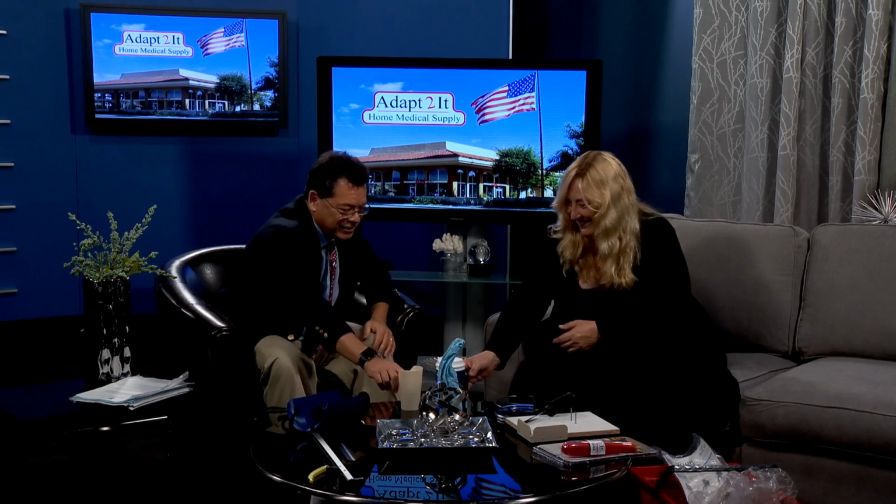Because when we drink, we don't realize it, but we tip our head back to get to the bottom of the cup. So this allows you to tip the cup up, have room for your nose, and maintain an upright position. Because when you tip your head back, you're more likely to take the fluid into your lungs. Very good. Or if you don't have any real problem except a big nose. Right, exactly. So that would work too.